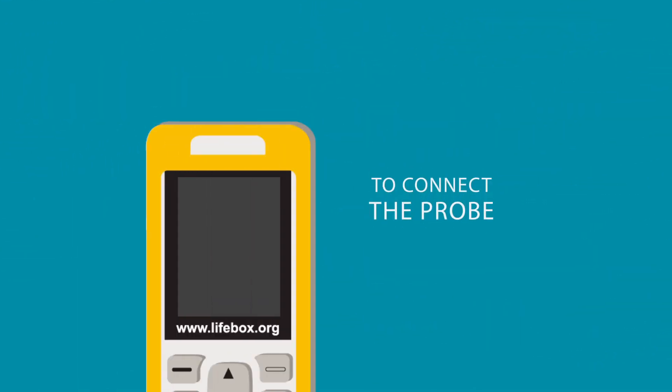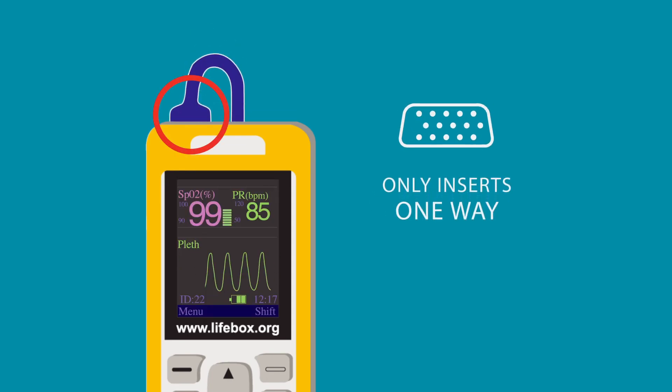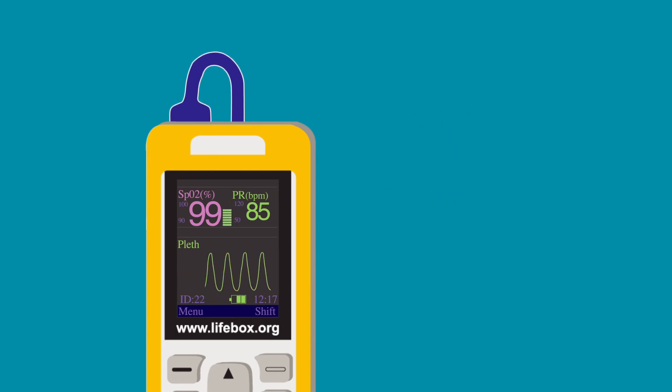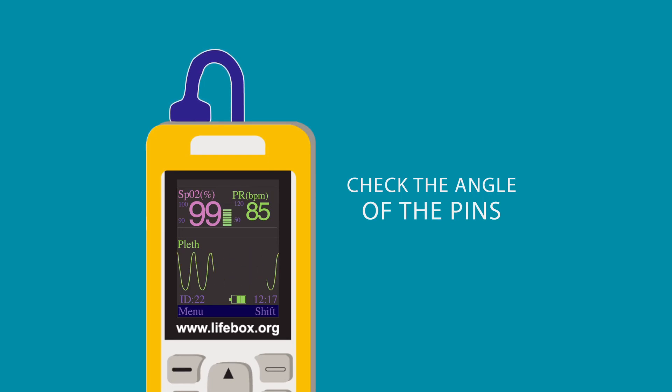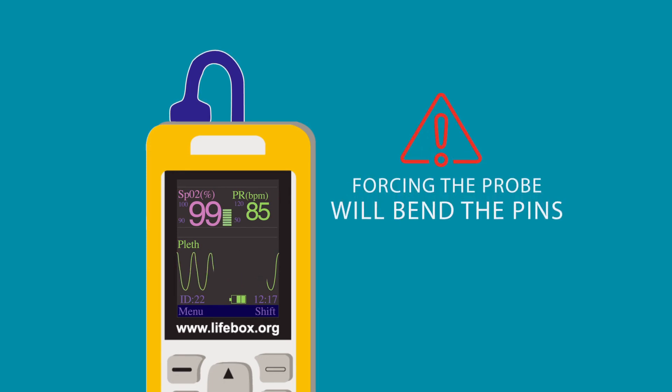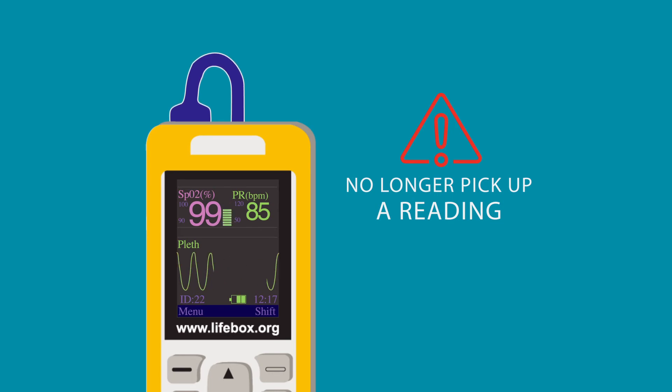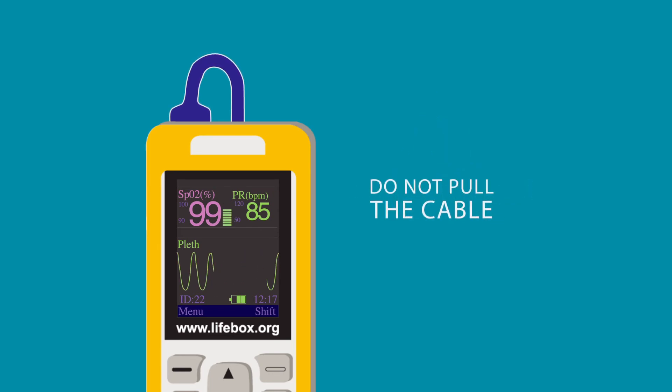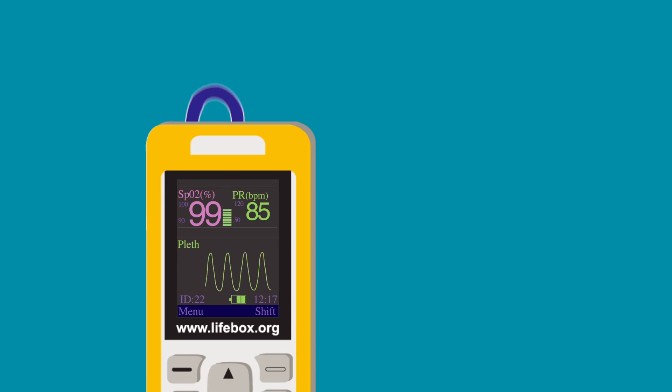To connect the probe to the oximeter, plug the base of the probe into the top of the oximeter here. Note that the probe only inserts one way. The pins are arranged in a sloping shape. It is very important that you check the angle of the pins and the angle of the receiving end of the oximeter before trying to connect the two. If you force the probe in upside down, you will bend the pins and the probe will no longer pick up a reading. When disconnecting and connecting the probe, grip the end firmly. Do not pull the cable to prevent the small wires inside from tearing.